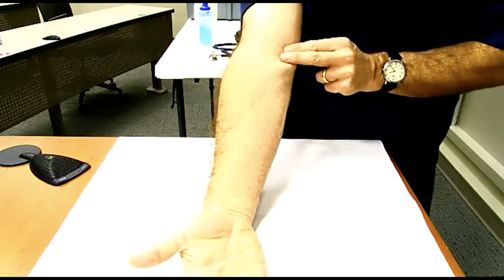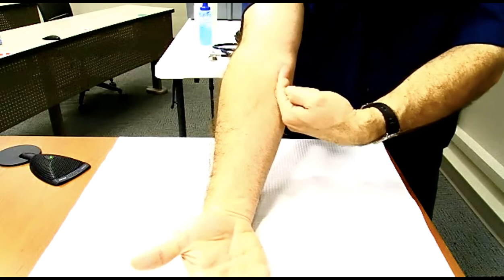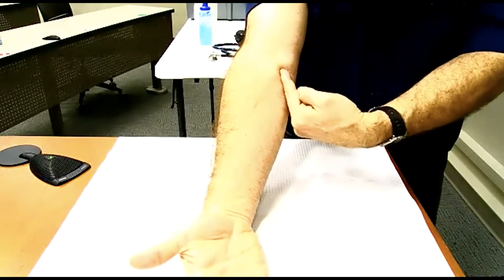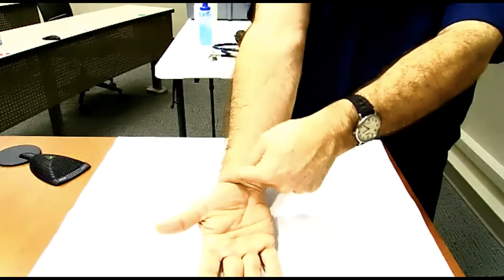So again, when we talk about the stethoscope, we're going to want to go not midline, but towards the pinky. So midline towards the pinky, right in around here, is where I'd want to put my stethoscope head, not over on the thumb side. But the thumb side is where the radial artery is, okay? So I know that can be confusing, and that's definitely part of what we need to practice today. If you're having any issues or problems with trying to do that, let us know, okay?